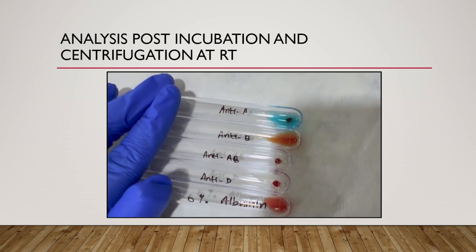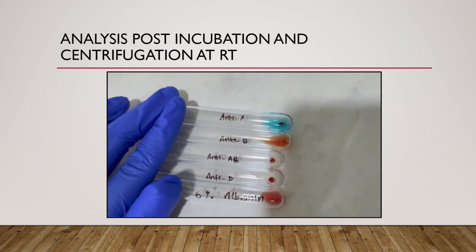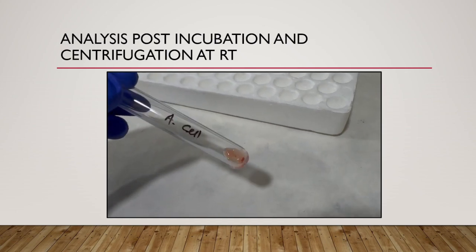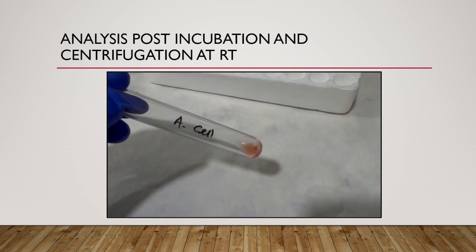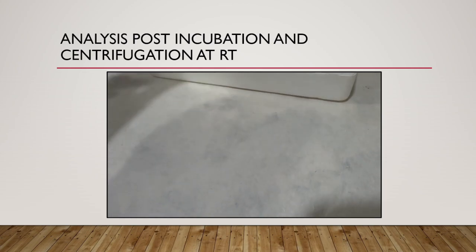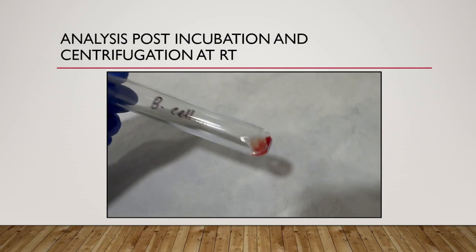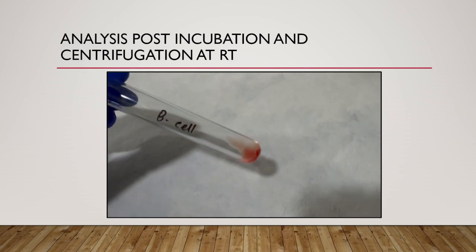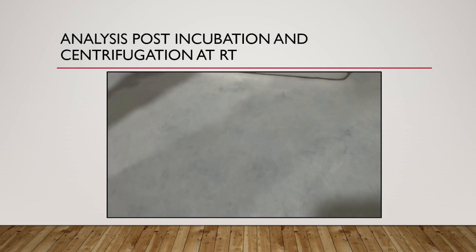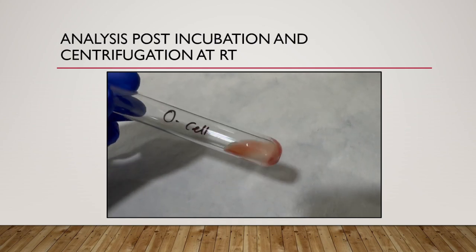From these tubes in the forward grouping we can infer that the probable blood group of the patient will be A positive. Coming to reverse grouping tubes, as we can see there is no reaction in A cell tube. In B cell there is no agglutination reaction. As we expected the group to be A positive from forward grouping, we expected to have a reaction in B cell, but there was no reaction in B cell.